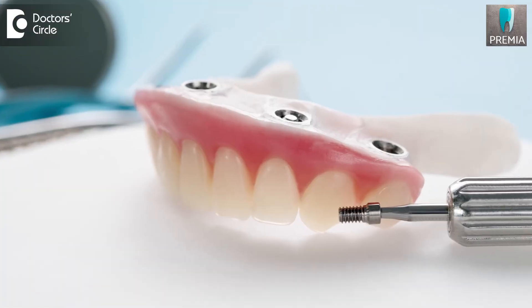Hybrid dentures are a very superior form of treatment and the patient will find it really comfortable. Even though it is a fixed form of treatment, the patient needs to come in for regular checkups where the dentist would remove those dentures.